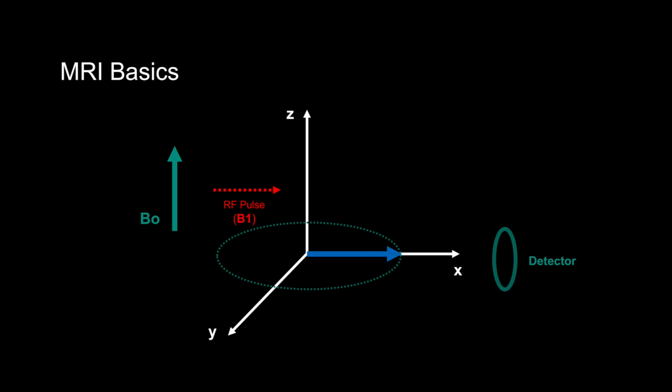So this is all great. We understand how we get MRI signal, but the key of any imaging is to differentiate tissues from each other so that we can anatomically look at organs and detect disease within them. So, how does MRI differentiate between tissues?